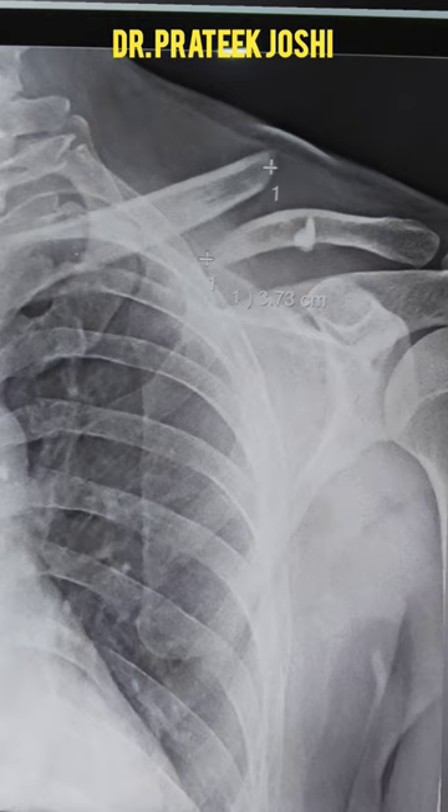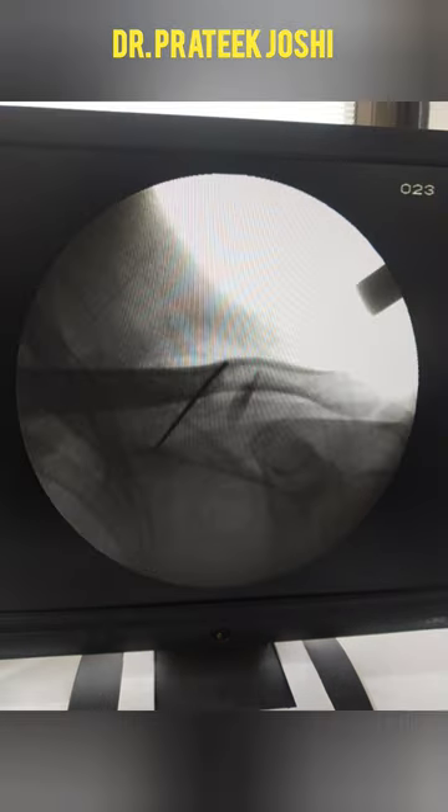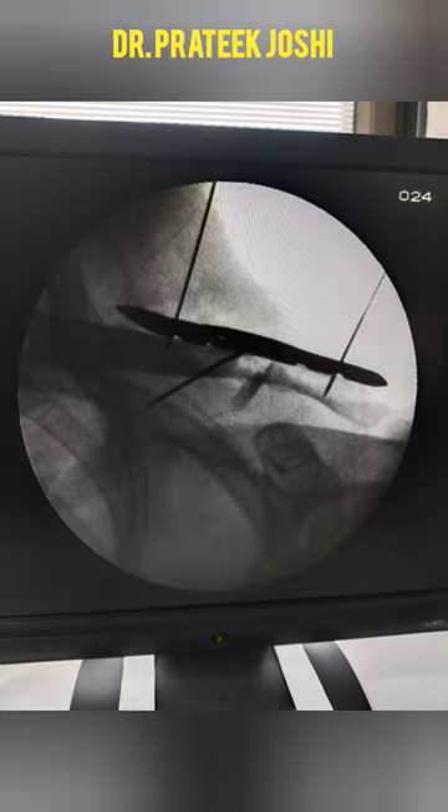We fix such cases for better outcome. In this video, I have shown the different steps of clavicle plating surgery, in which we first reduce the fracture and hold it with a K-wire, and then apply the plate.